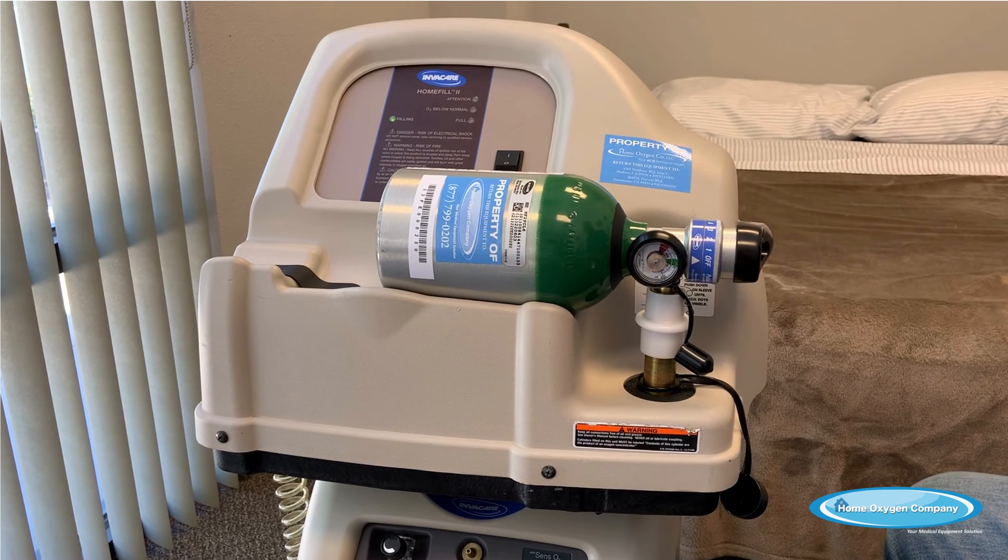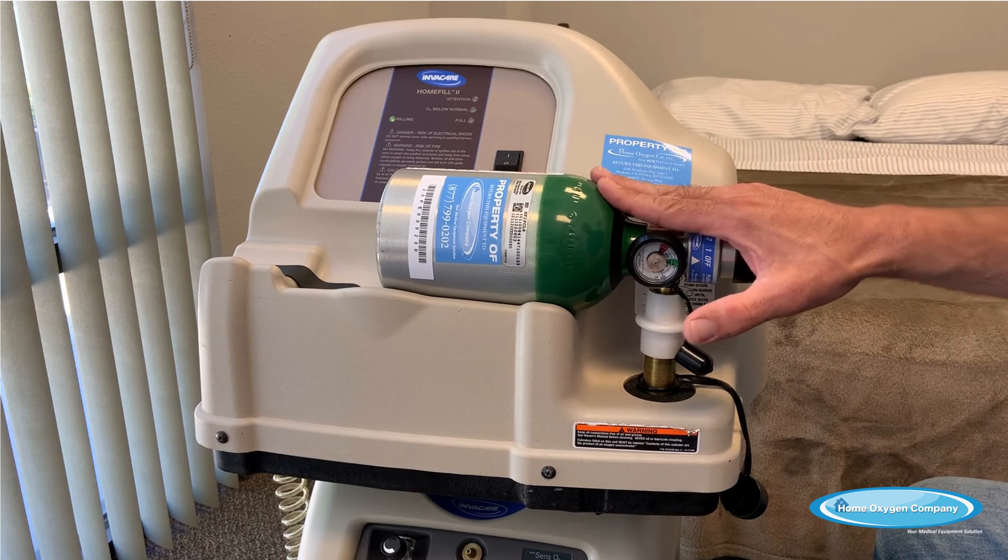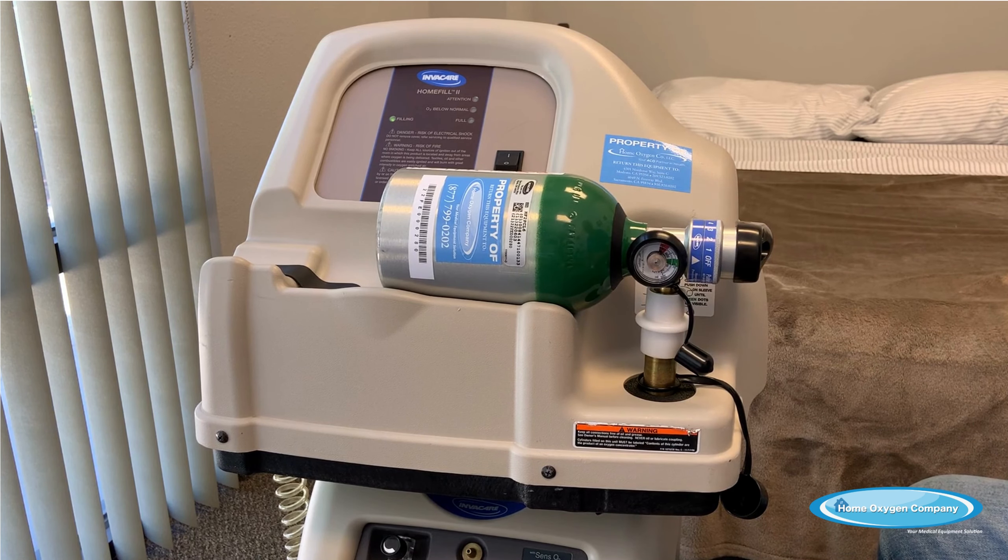We recommend that you keep both of your home-filled tanks that you've been issued full at all times, so that you're ready in the event of a power outage or if you're evacuated due to a natural disaster. You want to make sure you have all the ambulatory oxygen so you can pick up and keep your oxygen going while you find a place to relocate to.